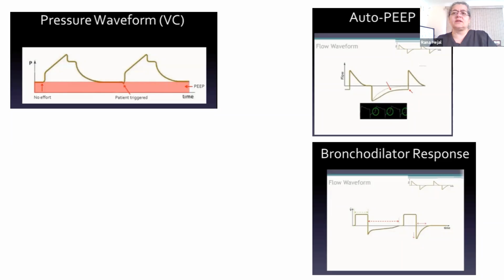So instead of focusing on the heart and the blood pressure, somebody should be adding up the bad effect of the ventilator that is causing the problem.